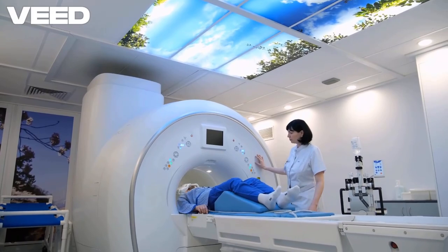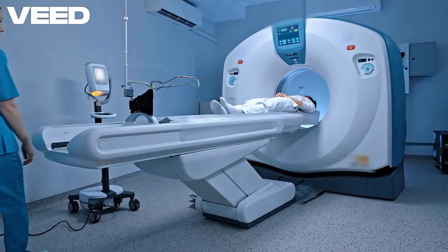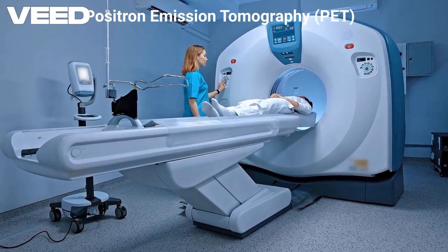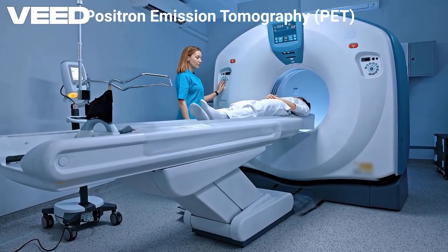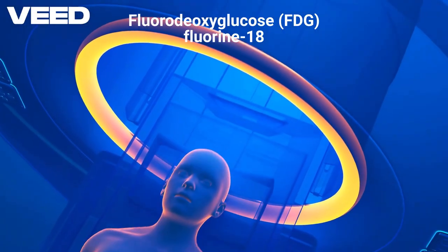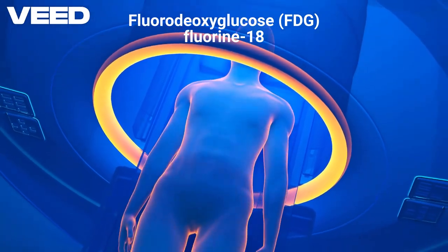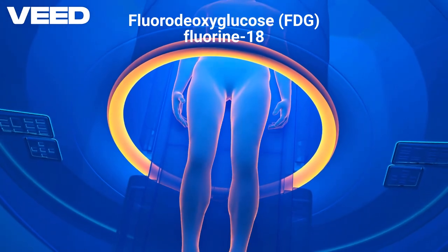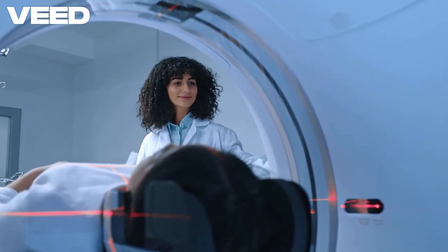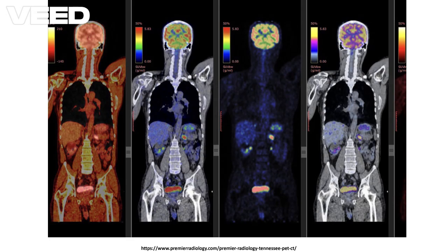Today, we are exploring one of the most powerful tools in cancer imaging, positron emission tomography, or PET scanning. PET scans work by tracking radioactive tracers, most commonly a glucose-based molecule called fluorodeoxyglucose, or FDG, labeled with fluorine-18. Since cancer cells consume more glucose than normal cells, these tracers tend to accumulate in tumors.